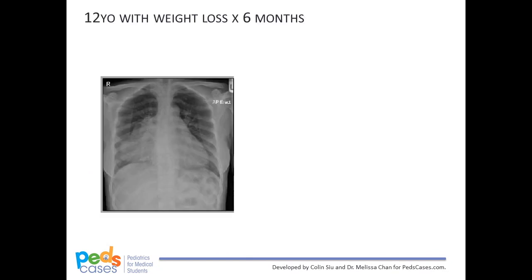Our second case involves a 12-year-old child presenting with weight loss over the last six months. The chest film is slightly underexposed as the vertebral bodies are not visible through the heart. Nine to ten posterior ribs are visible and the clavicles are equidistant from the spine. Let's take a stab at interpreting this chest x-ray. Are there any abnormalities present on the film and what is your diagnosis? Because this patient is 12 years old, we do not expect to see the thymus. On the film, there is an opacity at the right lower lobe of the lung and hilar vessels also appear more prominent.